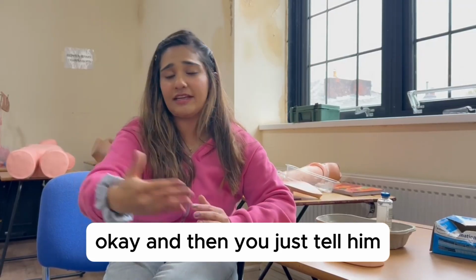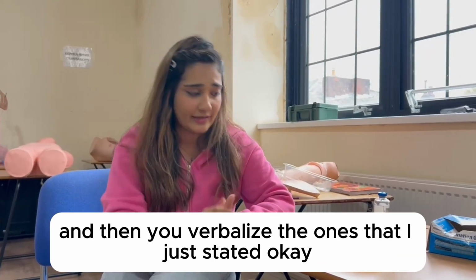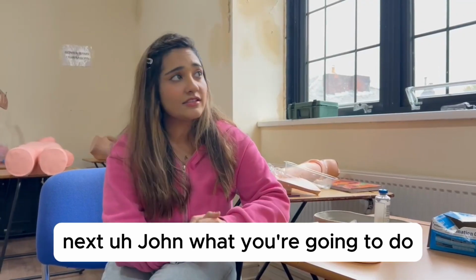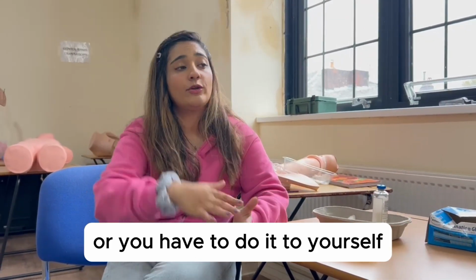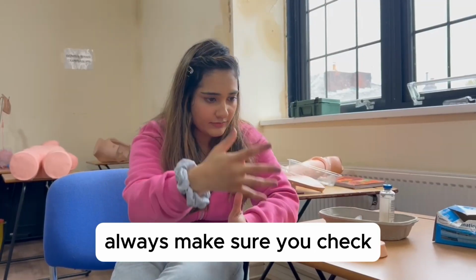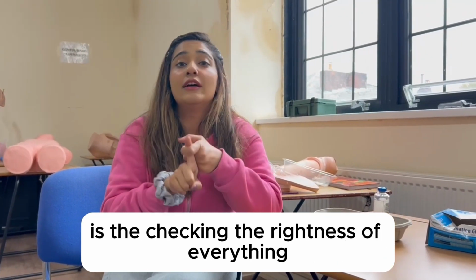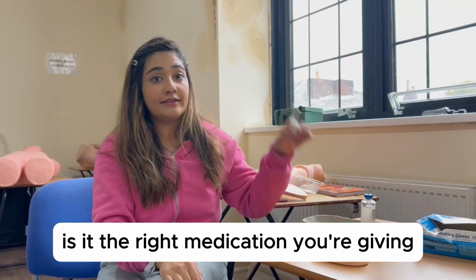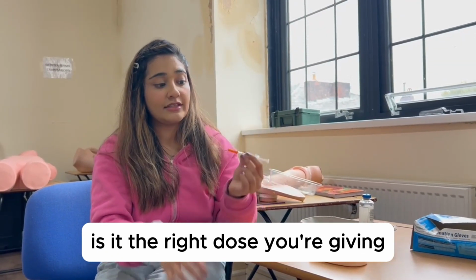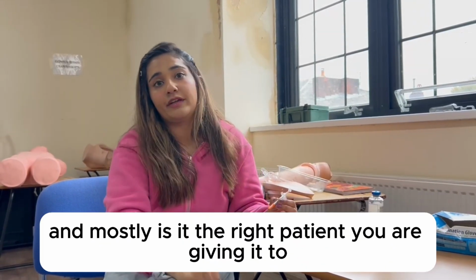Okay, and then you just tell him, do you know which medications we put through skin? And then you verbalize the ones that I just stated. Okay, next, John, always before you approach the patient, or you have to do it to yourself, always make sure you check. The most important thing in a subcutaneous injection is checking the rightness of everything. Is it the right medication you're giving? Is it the right dose you're giving? And mostly, is it the right patient you are giving it to?